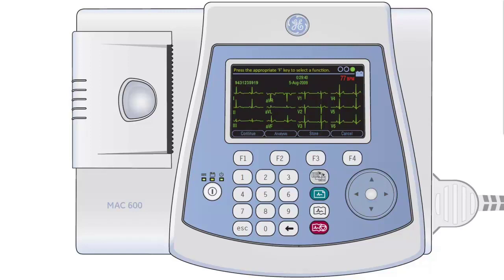The automatic interpretation can be viewed by pressing the F2 button. If the captured ECG is unsatisfactory, press the F4 button to cancel, which will take you back to the previous monitoring screen, allowing you to capture the ECG again.